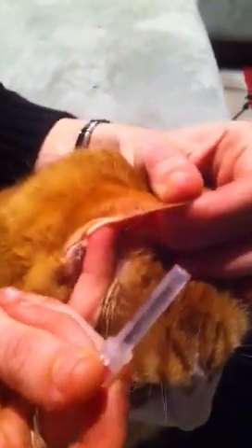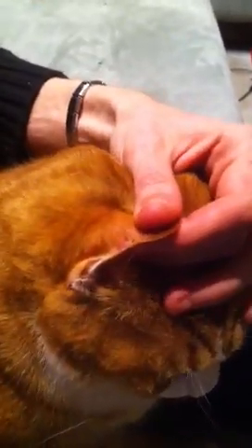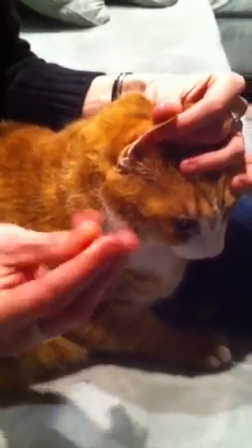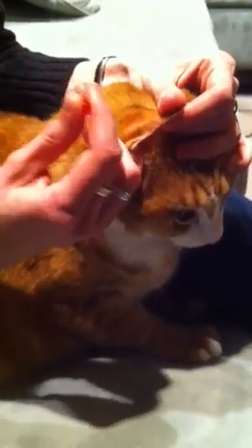I'm going to let Nicole tell you what she does here. What I do is: whichever hand is your dominant hand, have the needle in that hand. Take your pinky and put it in the base of your cat's ear.